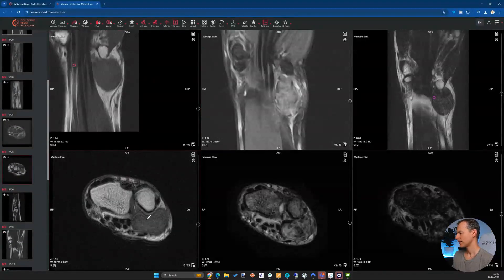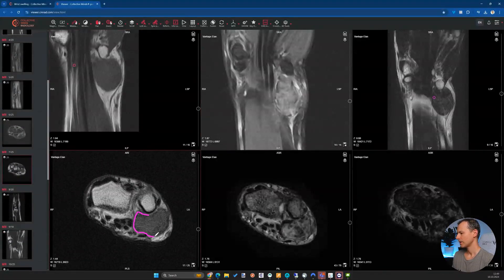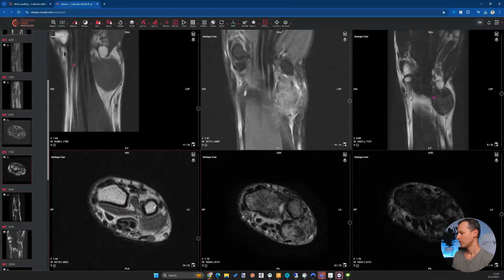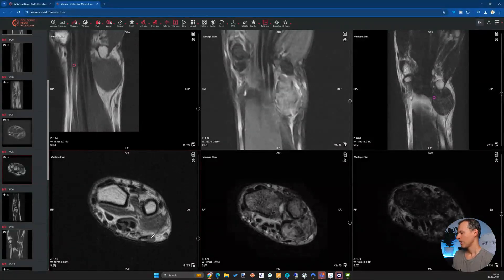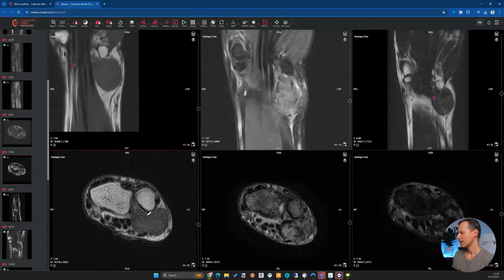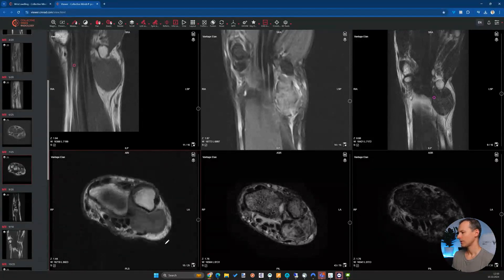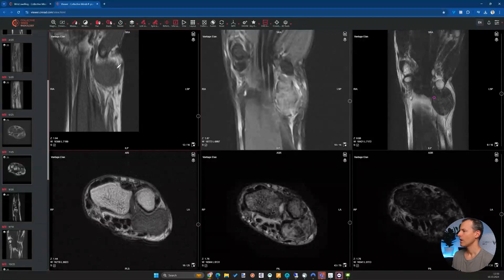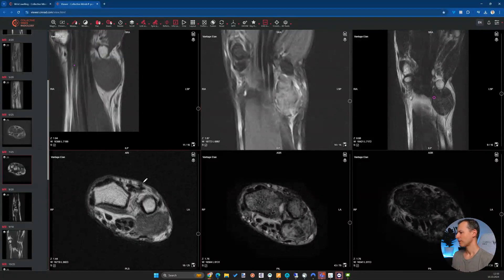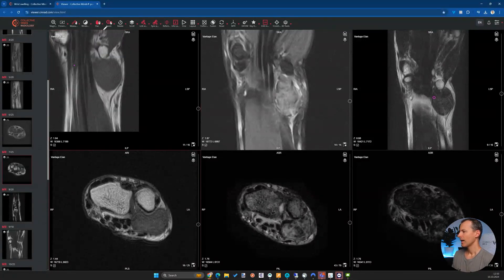We can check the other planes to see where the tumor is located. It sits between the distal ulna and the flexor carpi ulnaris and has a kind of dumbbell appearance, bulging a little due to its size and the tendon compressing it slightly. It's not within a muscle — it's mostly surrounded by fat tissue.